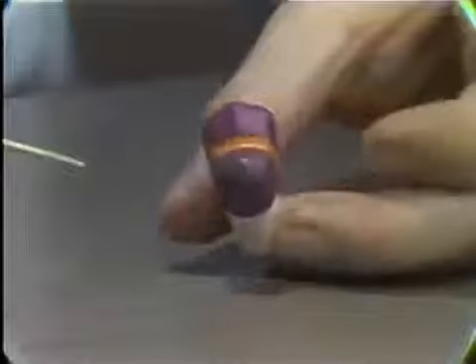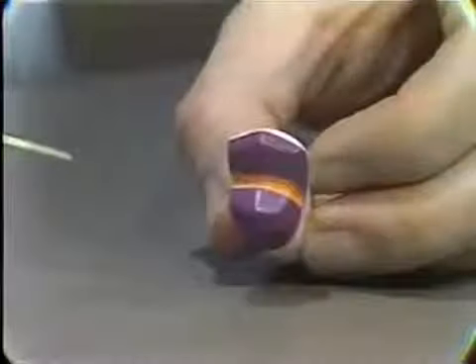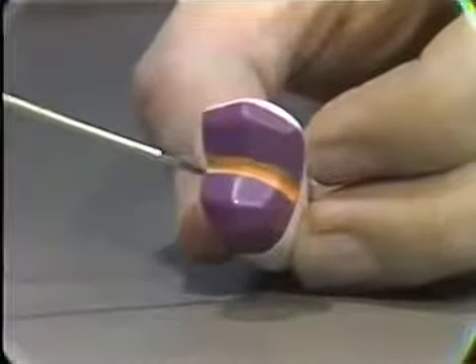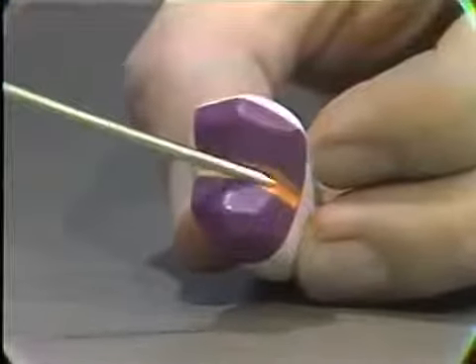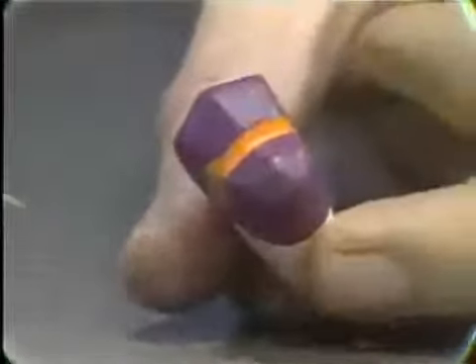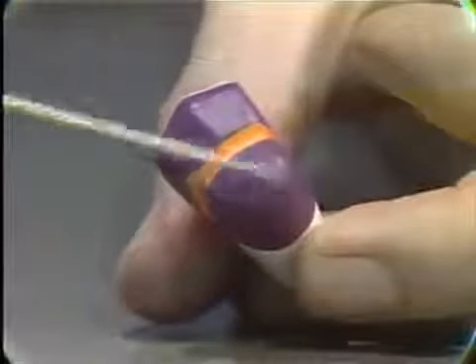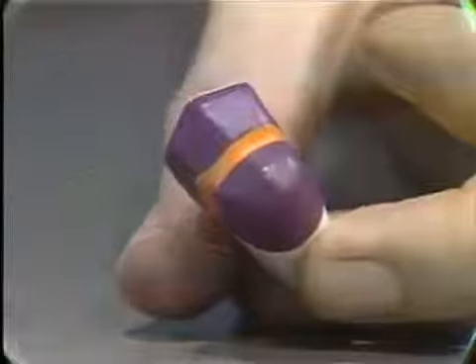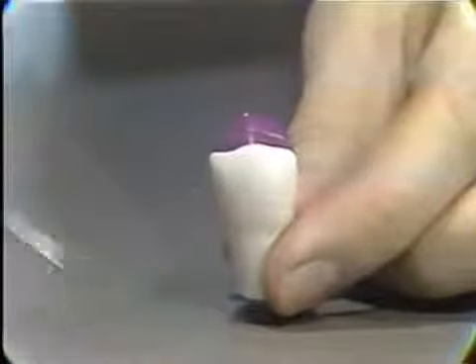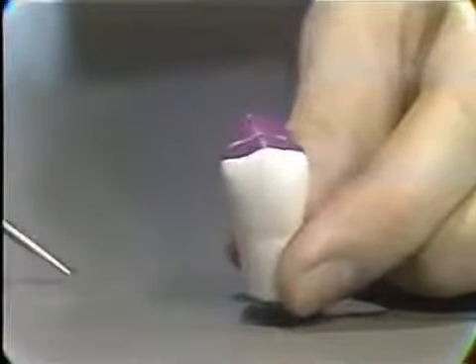It's the most conservative type of three-quarter crown, one in which the retention is gained merely by means of a groove on the proximal surfaces running across the occlusal and down the other side. You can see how this three-quarter crown type preparation gets its name from covering essentially three-quarters of the crown of the tooth. And that the labial surface, which is not prepared at all, is left in its original state, and so no change in aesthetics is produced in that regard.